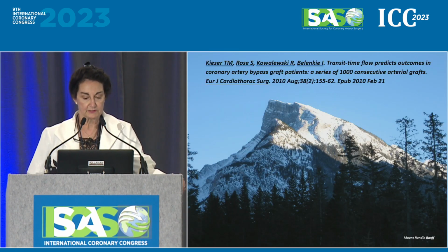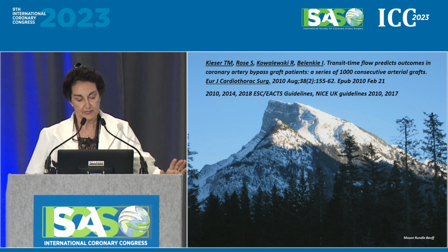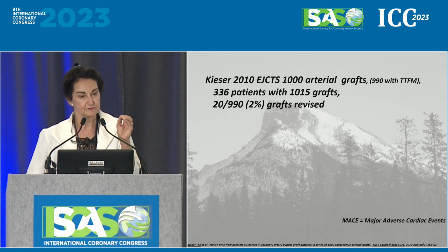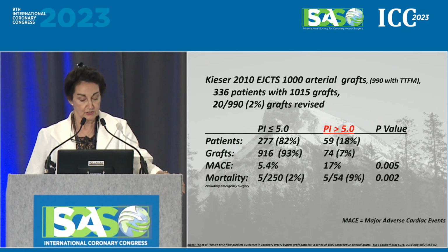I just want to make one note about the paper that we did 13 years ago. I did revise 2% of the grafts, and after having used this machine for about 3 years, I had no gestalt as to whether this made a difference or not to my practice. So I thought I would review it, and to my horror, I realized that if I had ignored the machine and thought I was right, I had harmed my patients.